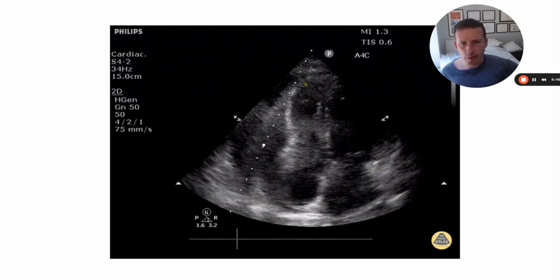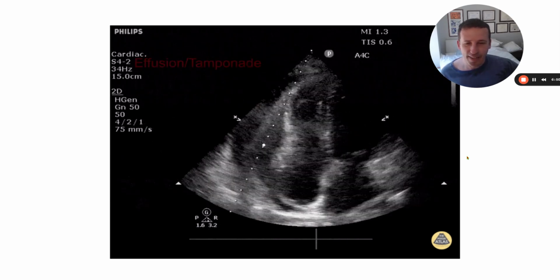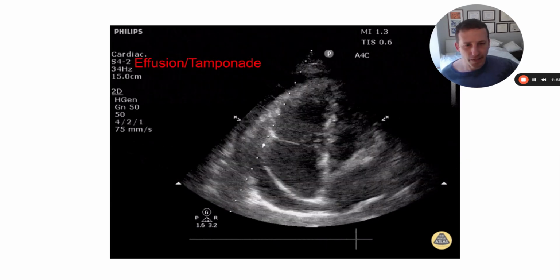This again, though, just a big old effusion, probably tamponade. It's moving a little too fast for my eye to pick up. Yeah, so the tamponade physiology here.